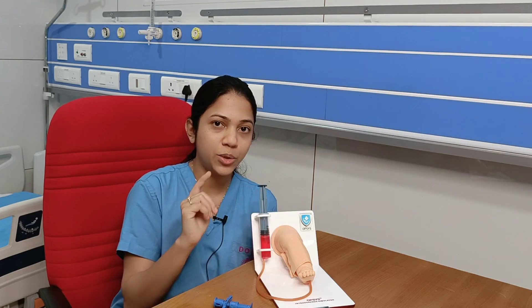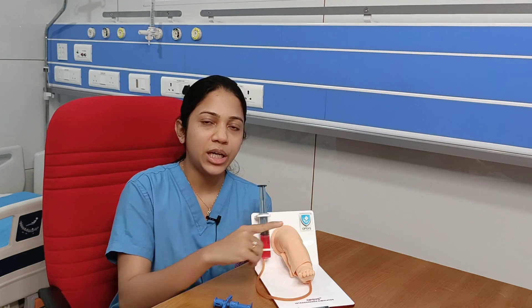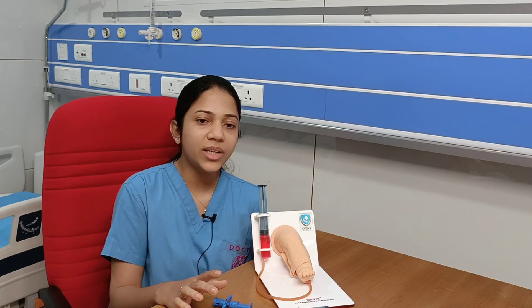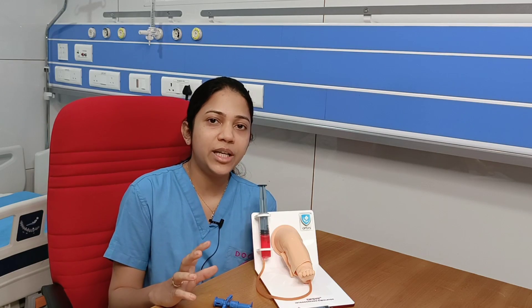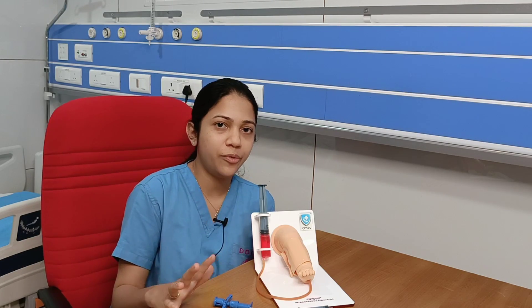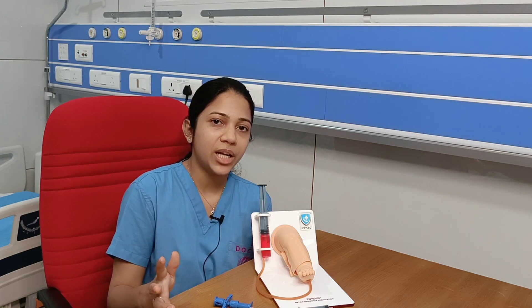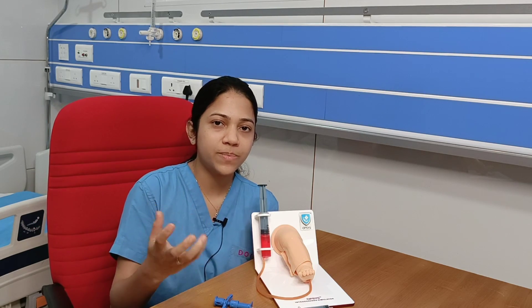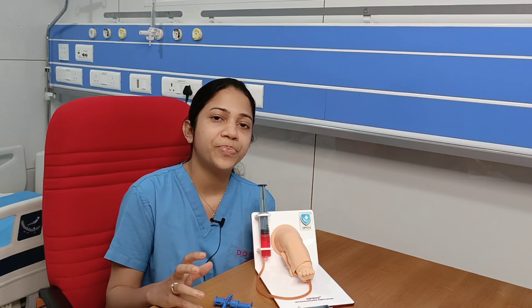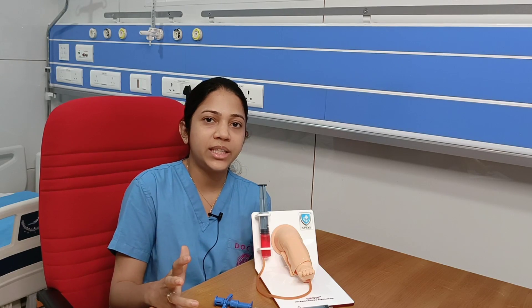In children, if IV access cannot be obtained, the most preferred site is the proximal tibia. For insertion, we do not use a standard IV cannula as it can get clogged. Instead, we use a Jamshidi needle, a bone marrow needle, or specific IO access equipment such as a bone injection gun or battery-powered drill.